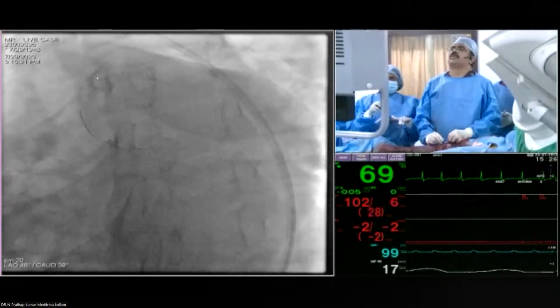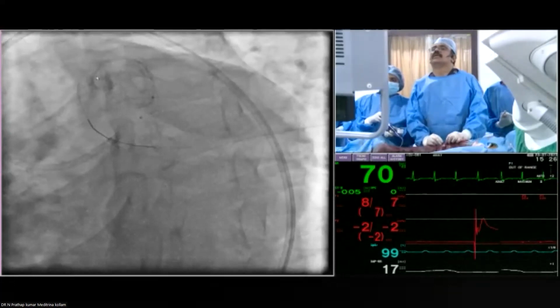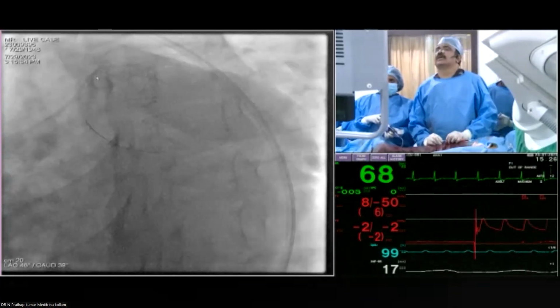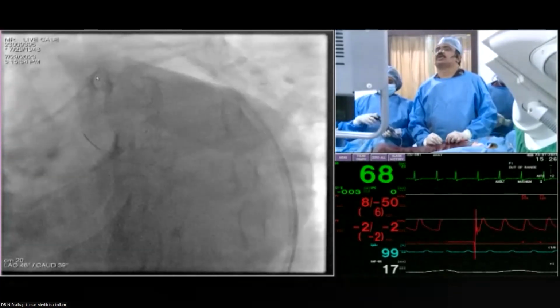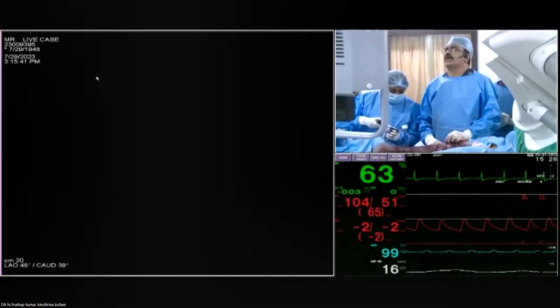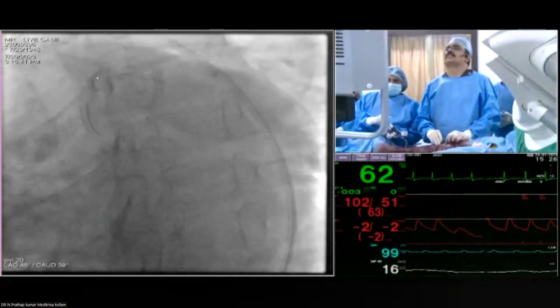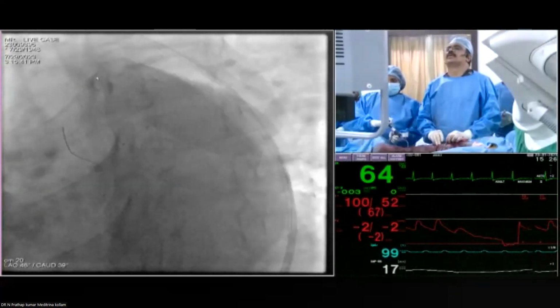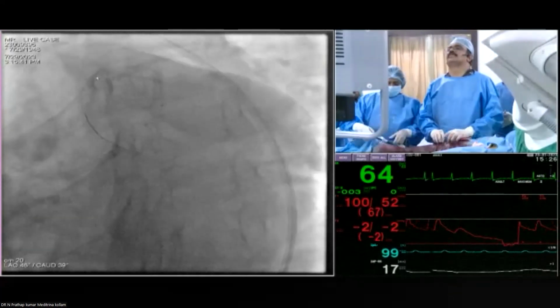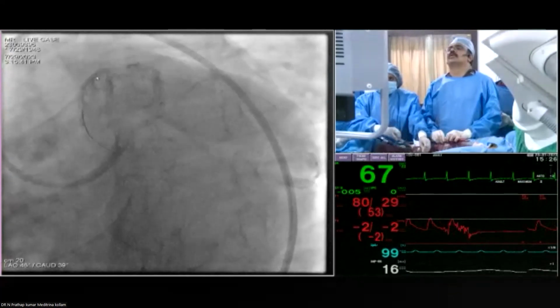This is actually the POT I'm trying to do. This POT is very essential to recrossing the side branch. So you may be able to recross as you told. Ideally the step should be like this. Go, 15. No, it came down. I think just go with the POT and then a small check with recrossing, and we would like to see this recrossing.